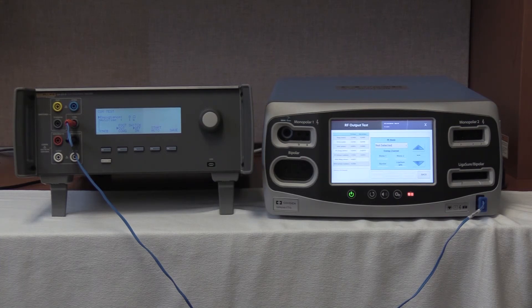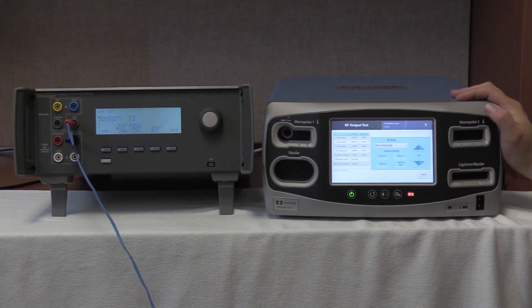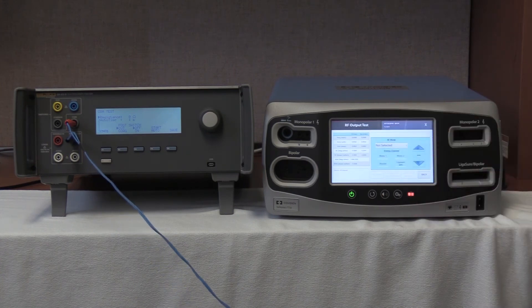The last step is to remove the cable from the REM port of the FT10. The Z-MAG measurement on the display should read less than 2,000 ohms — we are reading 1,391 ohms, so this FT10 passes the test. That is the completion of the Valleylab Covidien FT10 REM test.